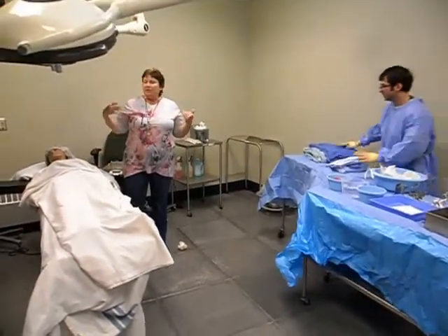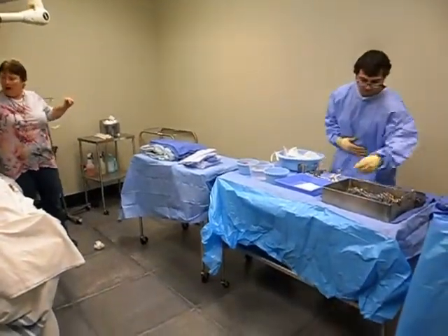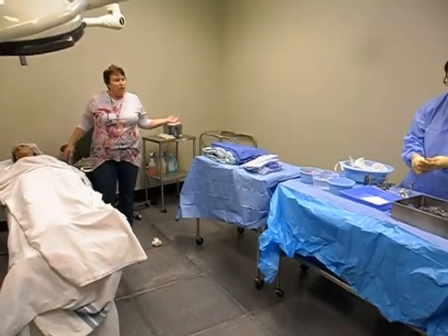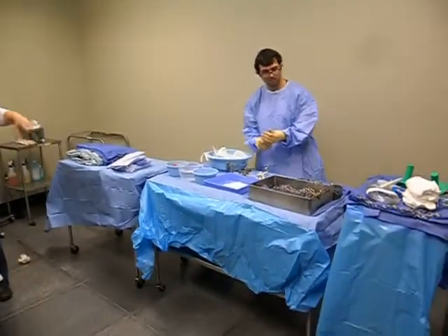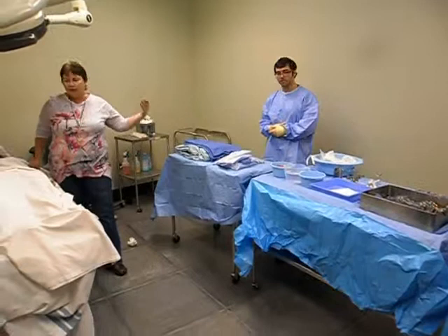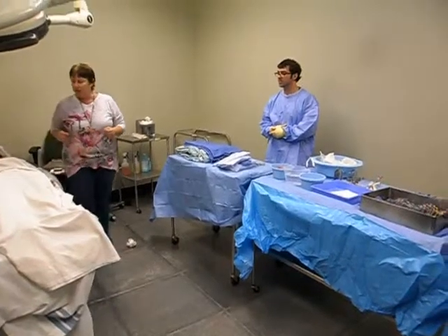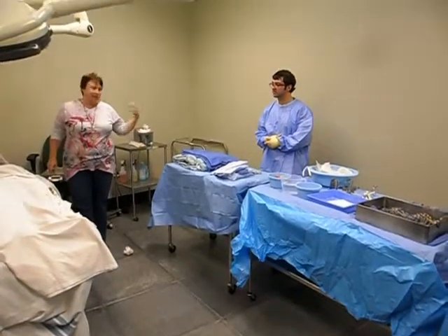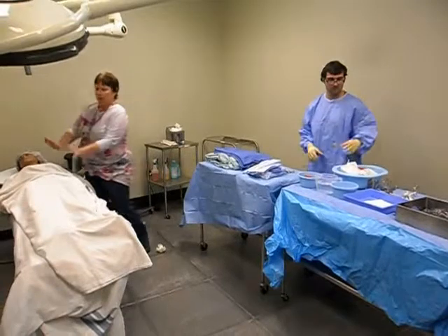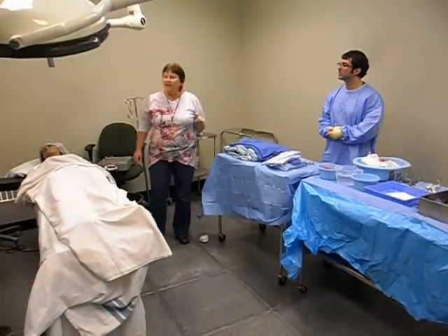Okay, now, this is the time that your RN needs to be with the patient. I need to make sure that my lights, of course, aren't way out of whack, that my Bovie machine is plugged in and ready to go. I should have done that ahead of time, my suction, everything. Joel gets to fiddle around a little bit. He's still got time to organize and do everything. And so we would have wanted him to have his meds by now, so he doesn't have to ask for them when I should be taking care of the patient. He wants to be able to label his saline or his sterile water and have it counted. Because now he can do the final touches while I'm over here. Maybe he wants to separate these out. Maybe he wanted to keep them folded, whatever. He's got some time to do this.